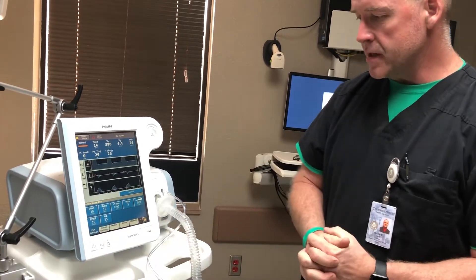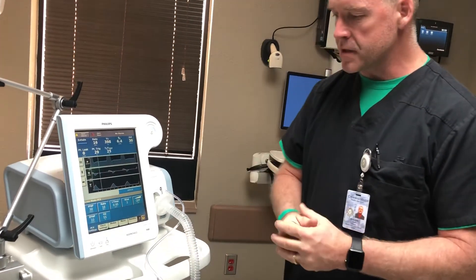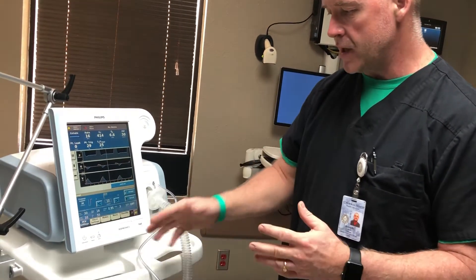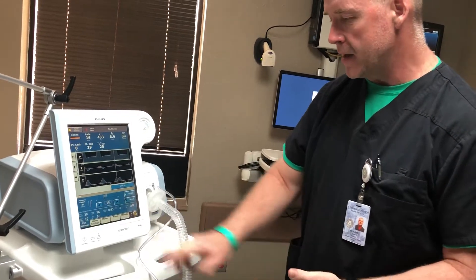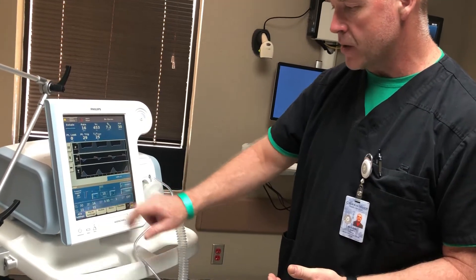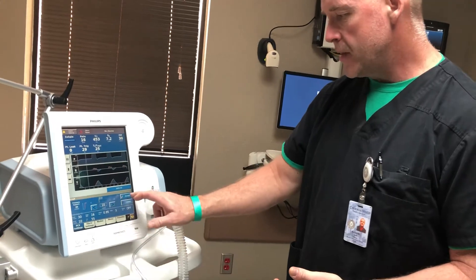Your EPAP is essentially your CPAP — continuous positive airway pressure. Right now it's at 10, but if you need to change it, you can go up and down accordingly to whatever the provider has ordered, then hit accept.